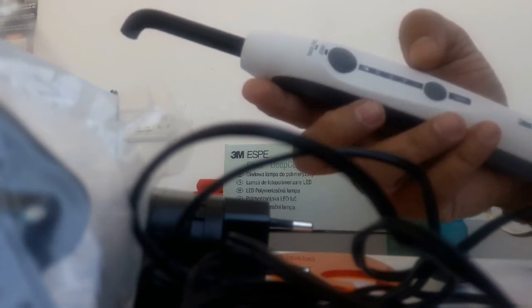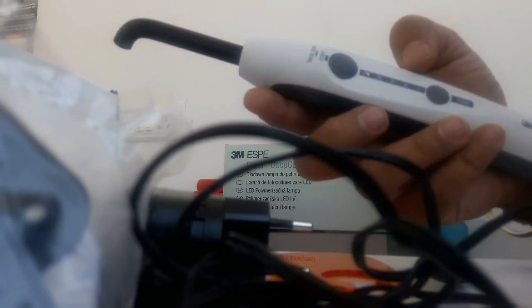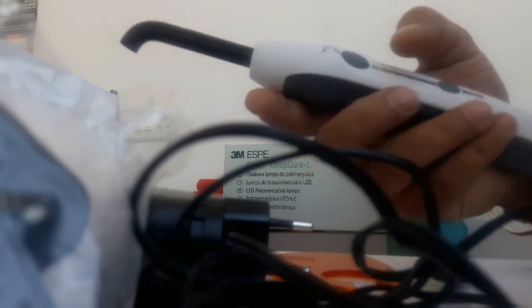There's a 10 millimeter light guide, which you can see here. This is the light guide, 10mm. You have 60 minutes of cordless operation.